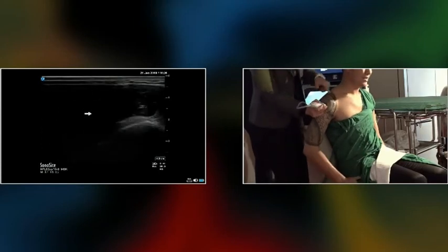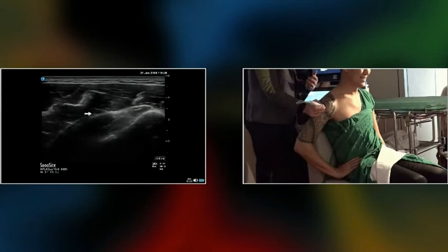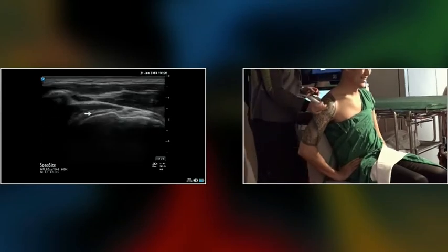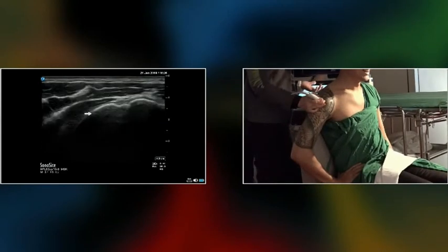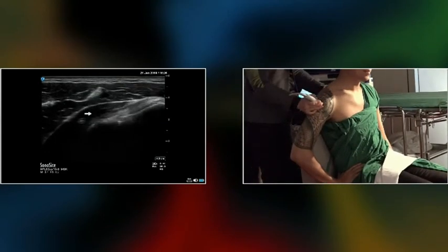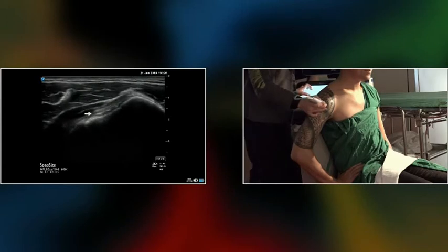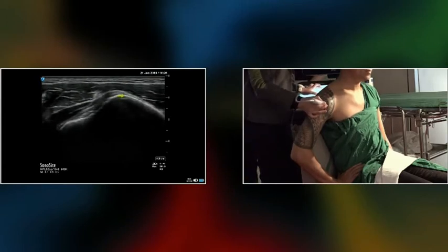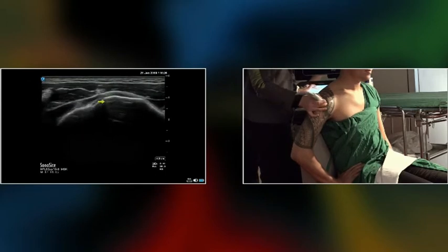Don't shrink up the shoulder. You see, he tends to shrink up. Okay, relax, drop down, okay? A lot of people are like this. So we try to scan, to try to see the most you can see here.